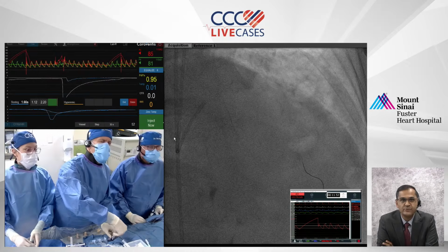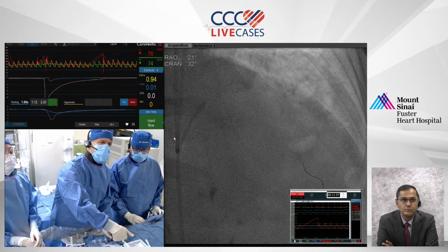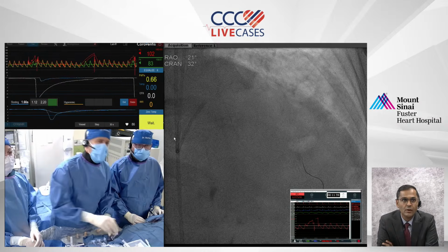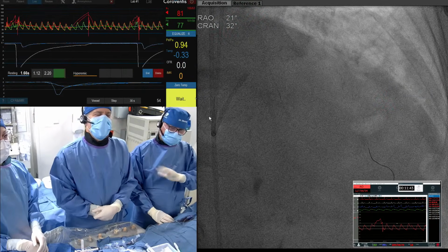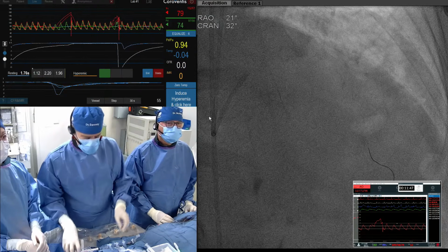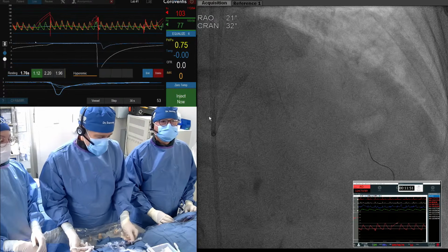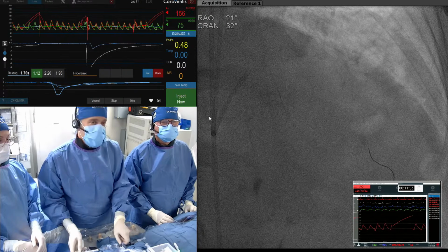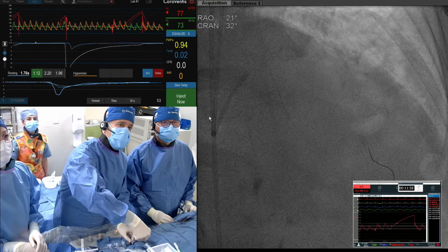And so, do you keep these, or do you repeat them? No, we repeat. We're looking for consistency. So the one test is, these curves look like it's probably on the slower side. You can get rid of the 1.1. And again, this might just be a function of, like I said, that slow coronary blood flow. Right. And given the tortuosity of this vessel.